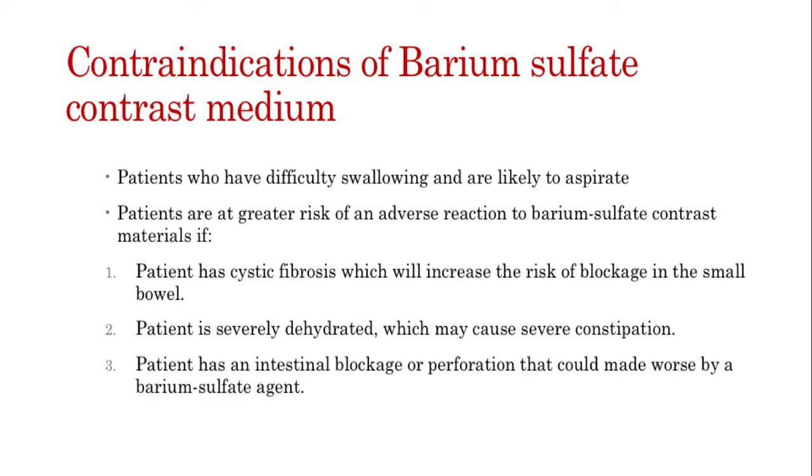And an intestinal blockage. So if the patient has a blockage, then you wouldn't ask for an oral contrast examination. His intestines are already blocked. Alright, so that means for clinicians, do not send your patient to have a barium scan or an oral contrast examination if you are suspecting perforation.